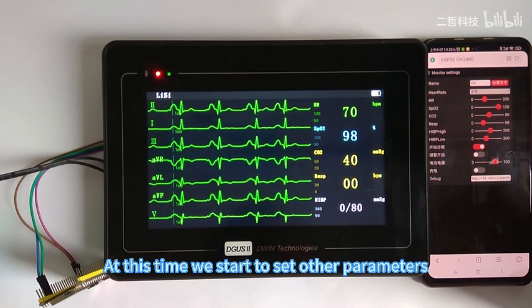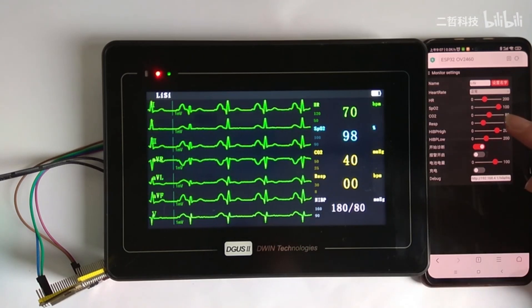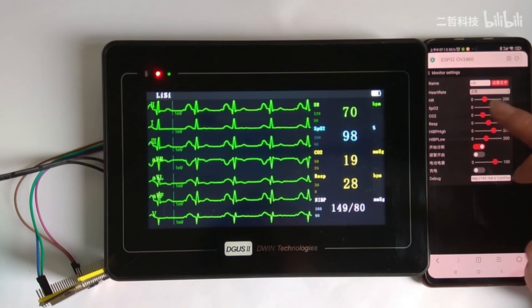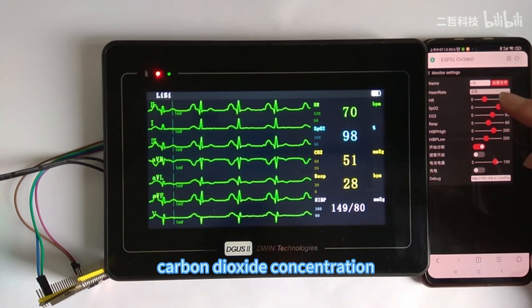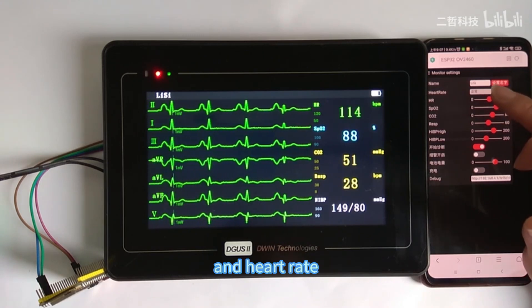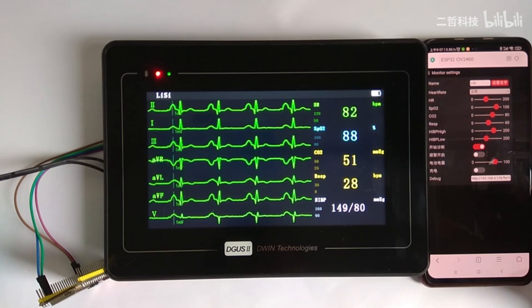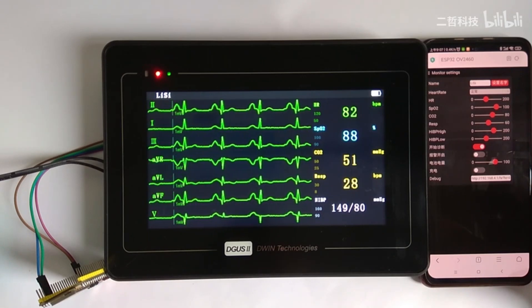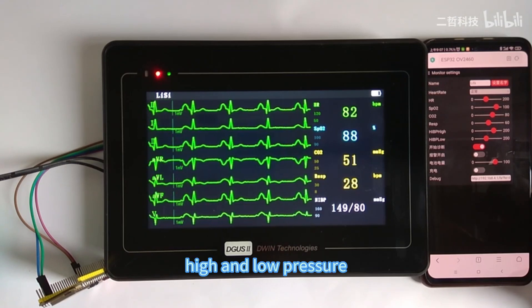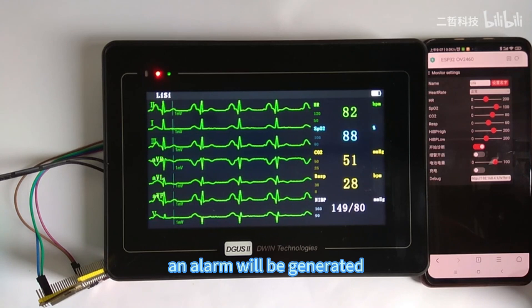Then we start setting other parameters: blood pressure, respiratory rate, carbon dioxide concentration, blood oxygen concentration, and heart rate. When blood oxygen, heart rate, carbon dioxide, respiratory rate, or high and low pressure values exceed the normal range, an alarm will be generated.